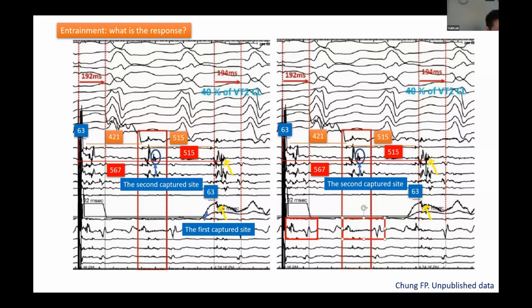However, we also recorded some signals, probably from some outer loop, or signals that did not belong to the channel. Therefore, it will take a shorter time to return back to these signals, right?